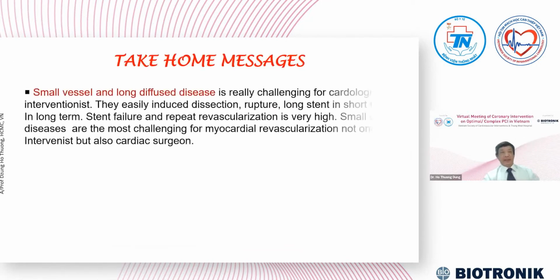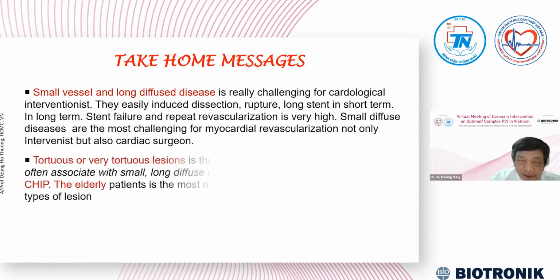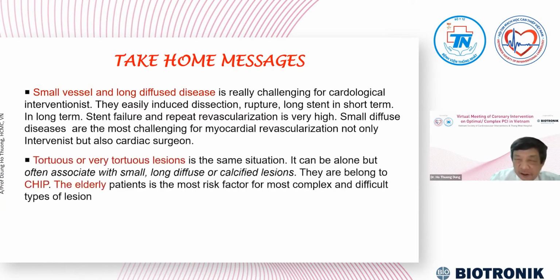So that's the message. Small vessel and long diffuse lesion, I have already talked about in the beginning. It is really challenging for the cardiac interventionist. They easily induce dissection, rupture, long stent in the short term, and in the long term the clinical outcome is not good. Stent failure and repeat revascularization are very high, and it is the most challenging not only for the interventional cardiologist but also for the cardiac surgeon. Tortuous or very tortuous lesion is the same situation.